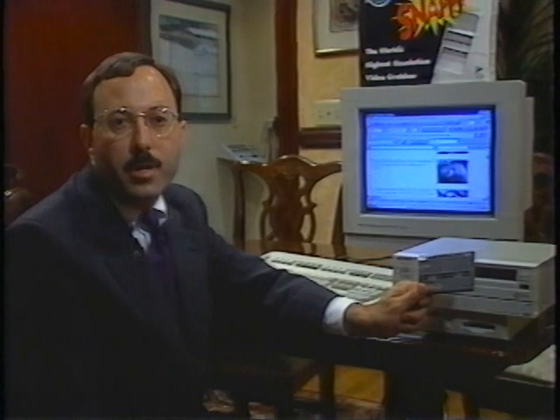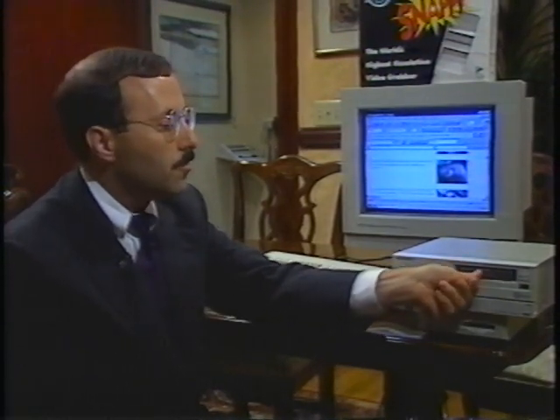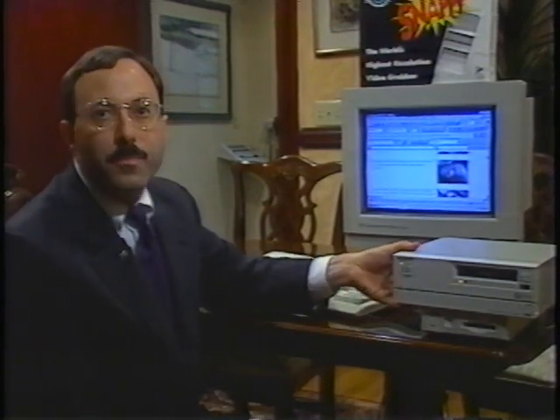It uses a small Hi8, Super 8 type video cartridge that goes right into the unit. And then you can use this to record. It's lightweight and portable. You can transport it from room to room if need be, and then you can transfer the information onto a standard VHS size tape to give the patient.